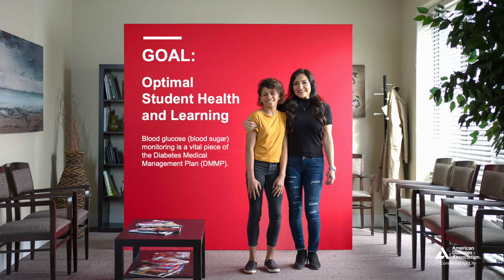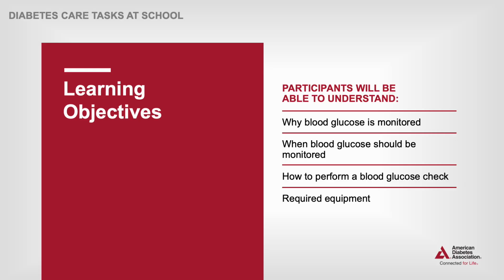This unit is blood glucose monitoring. Participants will be able to understand why blood glucose is monitored, when blood glucose should be monitored, how to perform a blood glucose check, and the required equipment.